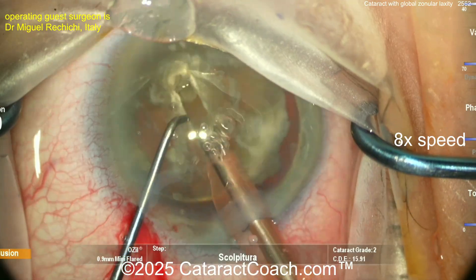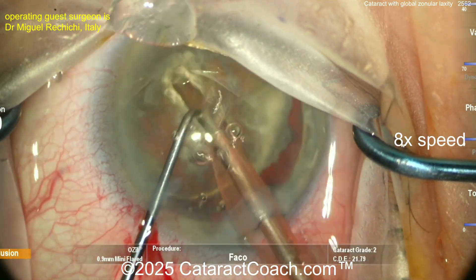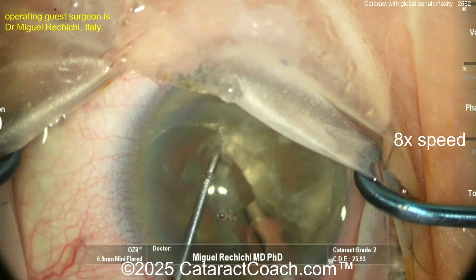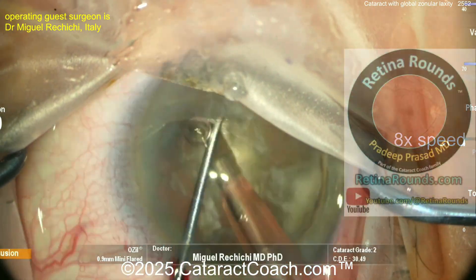Now let's see the technique going in here. Looks like a groove down the middle. And now we're watching the nucleus being split.